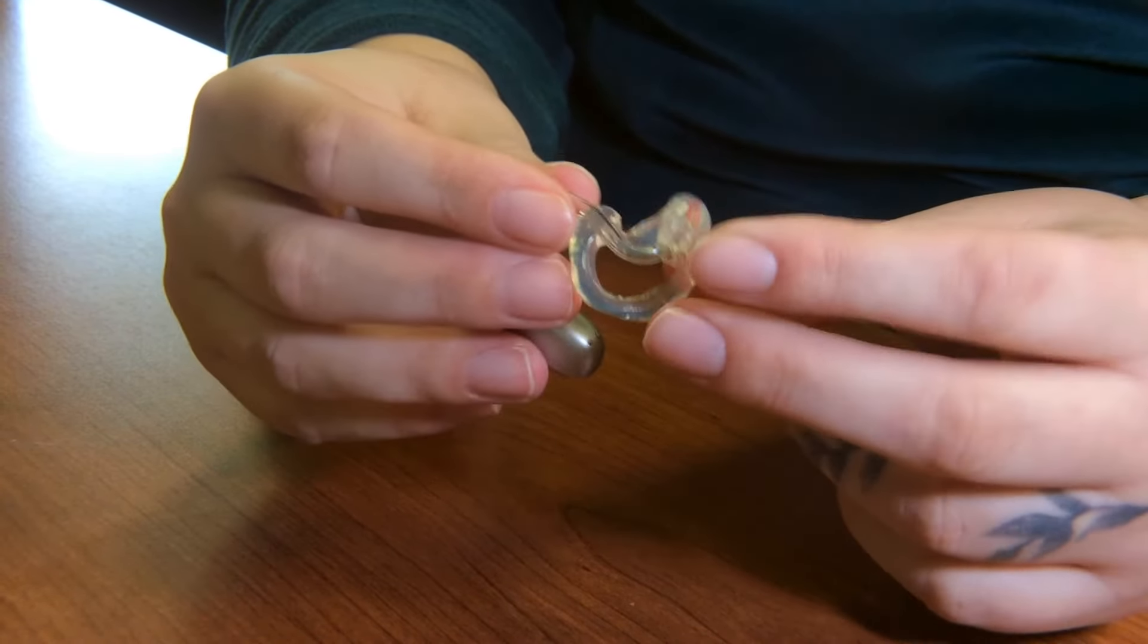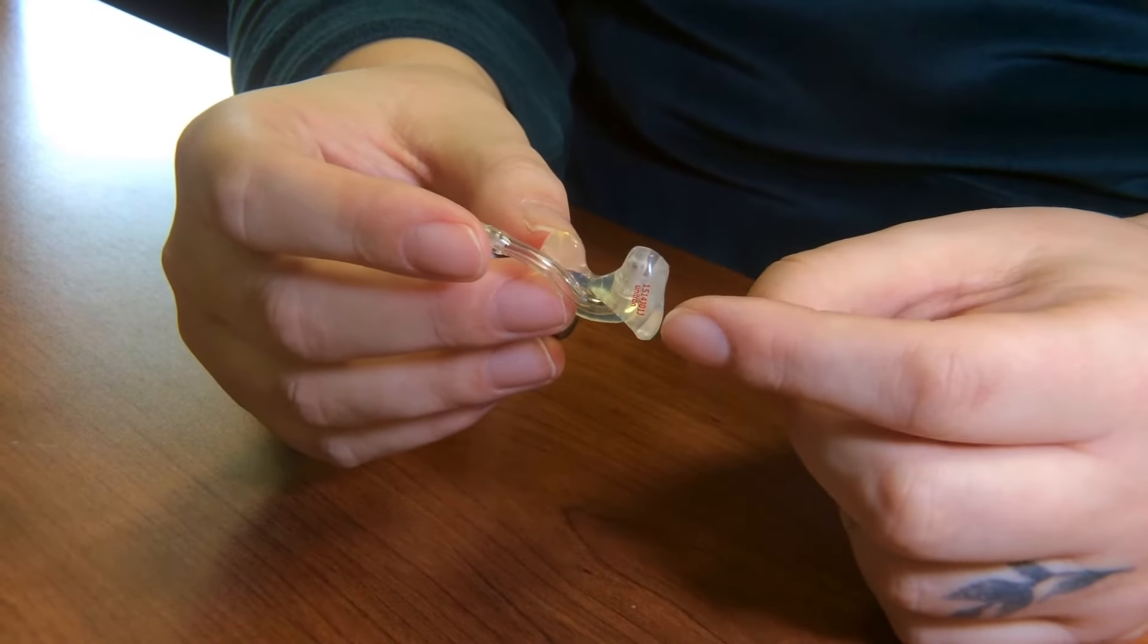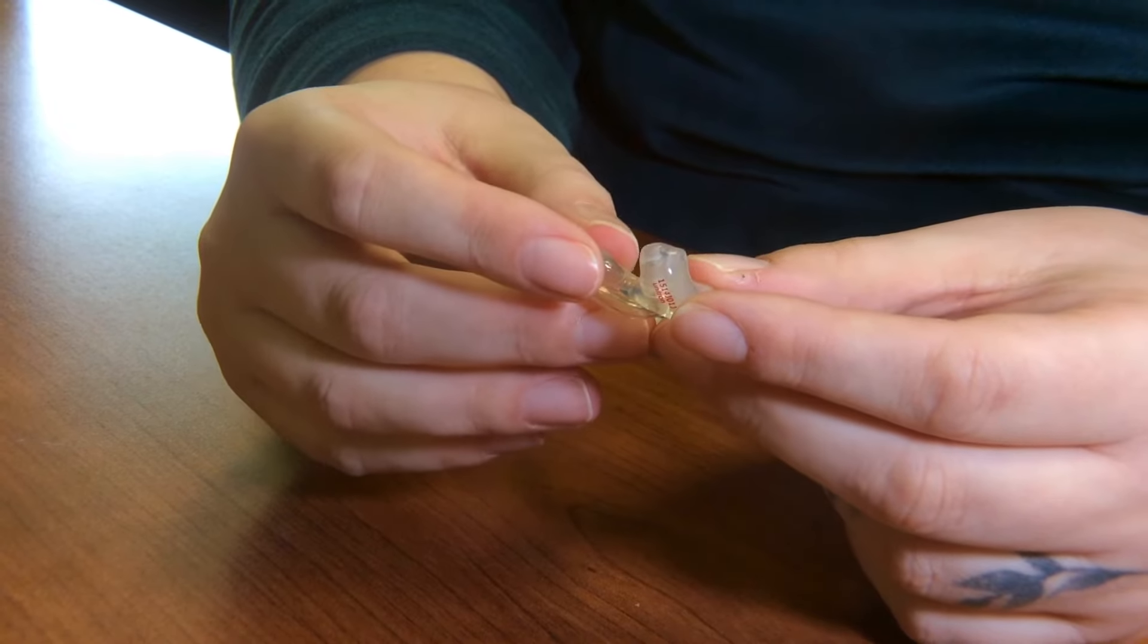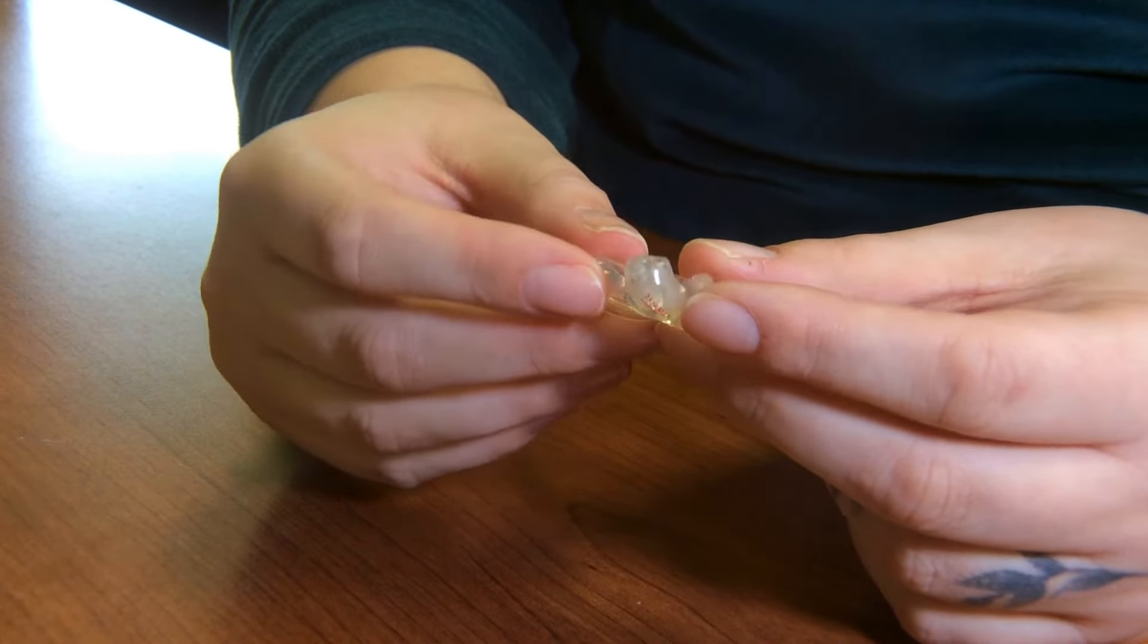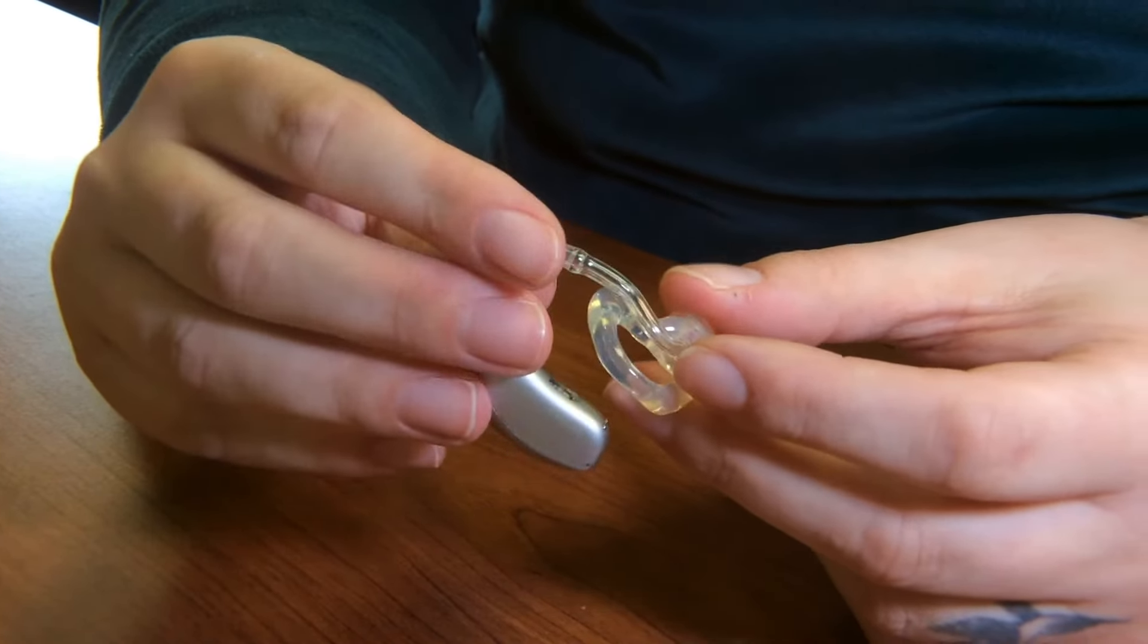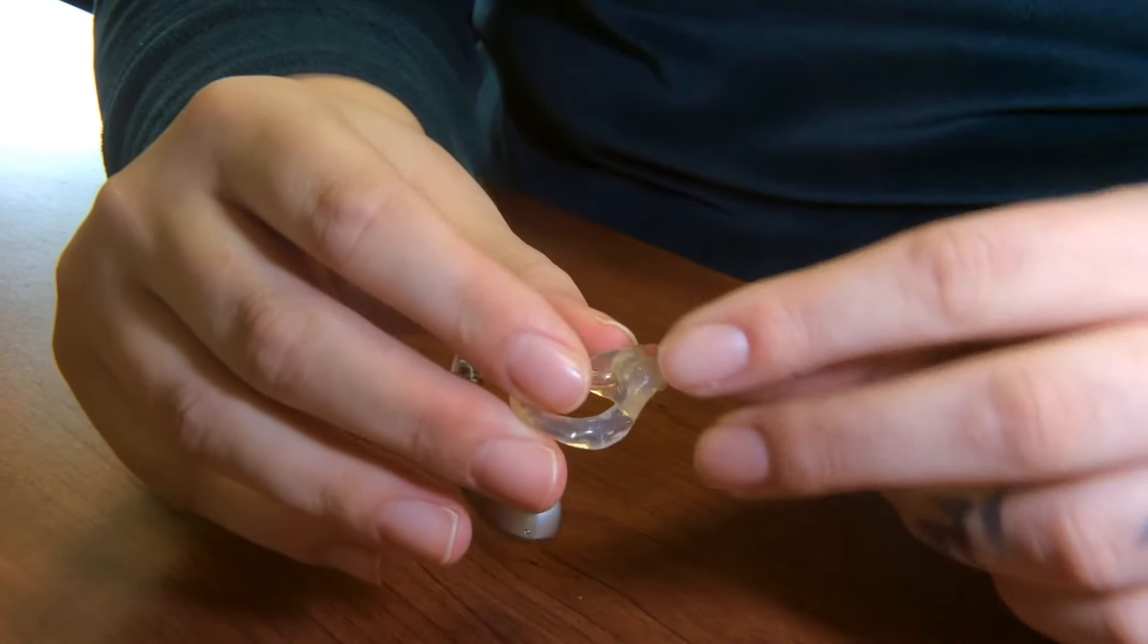So the first thing that you're going to want to look for visually is on the ear mold. You want to make sure that there are no cracks, that there's no debris like wax stuck in any of the portions of the ear mold, and that there is no moisture that is hiding out in any of the vents.